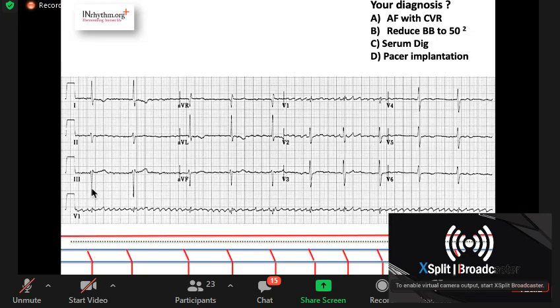Then, if you look from below the AV node, the conduction is quite irregular. Then there is some kind of regularity here. So there is a baseline, the patient is having an atrial flutter or a fibrillation. Then the AV nodal conduction is variable, but it is slow and it is regular. Here, if you look at it, it is quite regular.